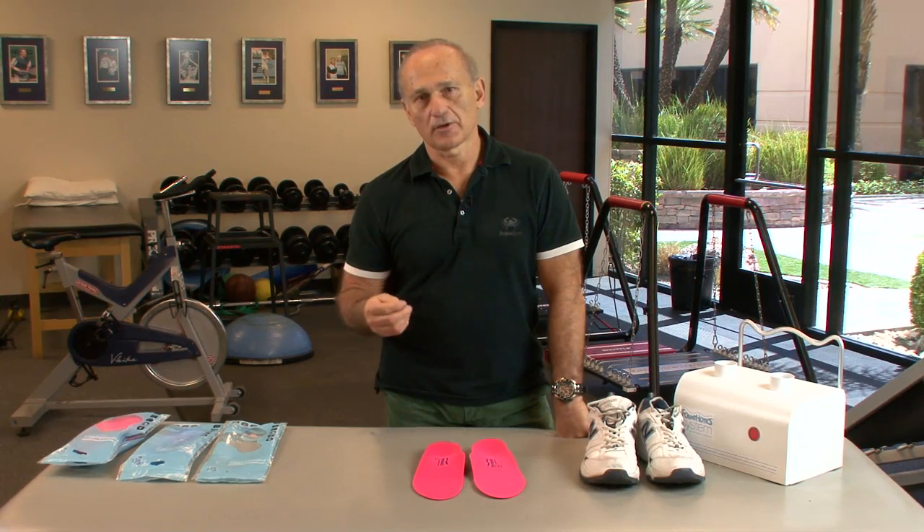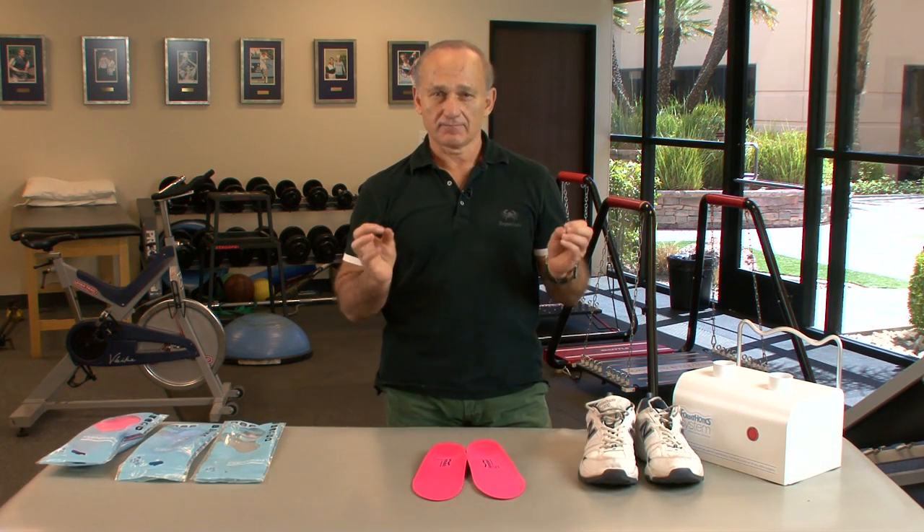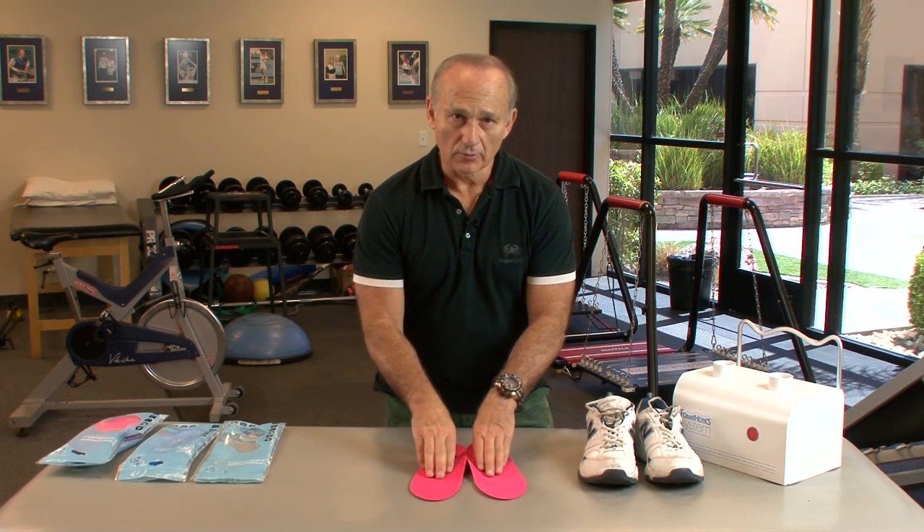Now we're going to talk about a really important part of using this product in the clinic and making it specific for your patients, which is called thermoforming. What does that mean? Heating the orthotic up, and the orthotic is going to mold to the foot.